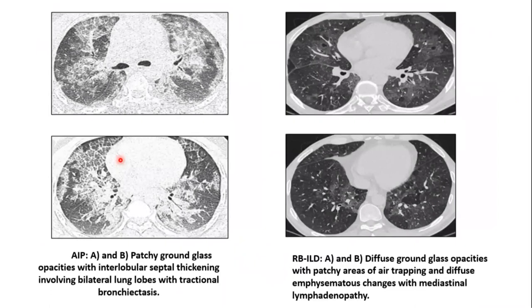The second case is acute interstitial pneumonia. In acute interstitial pneumonia, it is a fulminant form that usually causes diffuse alveolar damage, typically in a previously healthy individual. The classical CT findings will be patchy bilateral ground glass opacity with consolidation, which is predominant in the posterior segments of the lung. There can be architectural distortion, traction bronchiectasis, or honeycombing as the disease progresses. In this case of AIP, we can see patchy ground glass opacity with interlobular septal thickening involving bilateral lung lobes with traction bronchiectasis.